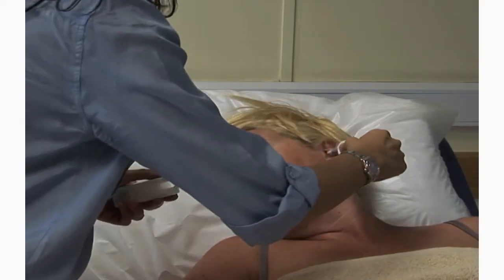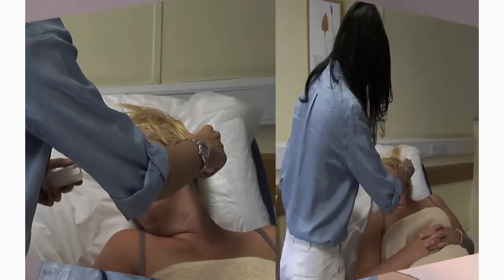Could you now offer us some advice on measuring temperature? Yes, of course. There are various methods of taking a patient's temperature. We prefer using the electronic variety as they're fast and reliable, and the disposable sleeves make this very easy.